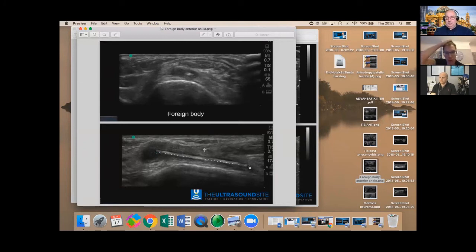And I actually ended up going to my podiatric surgical colleagues who removed it under ultrasound. She did really well. But you can see here, interestingly, the body kind of seals it off in a kind of halo around it. It's interesting how the body reacts to these things and just locks it down, seals it off, and puts it into a capsule. So you often have, around a foreign body, this hypoechoic area of tissue around it.